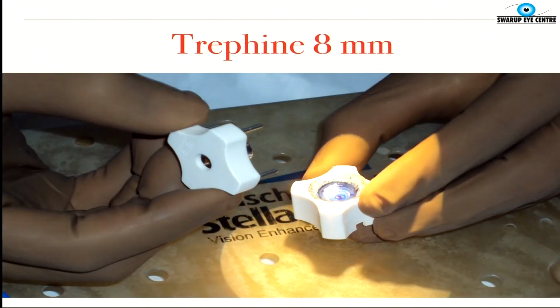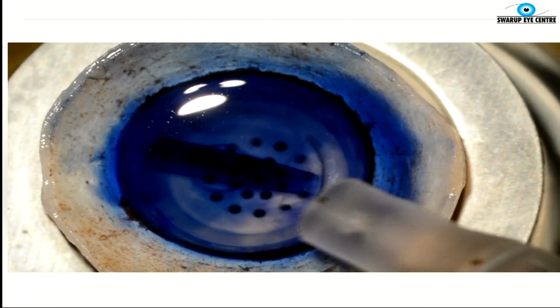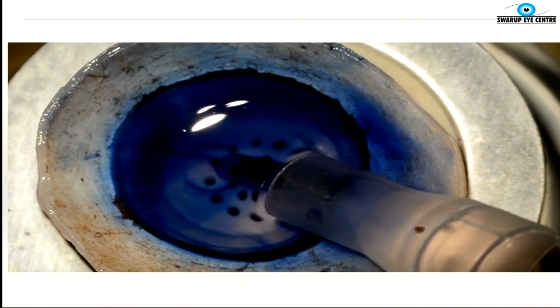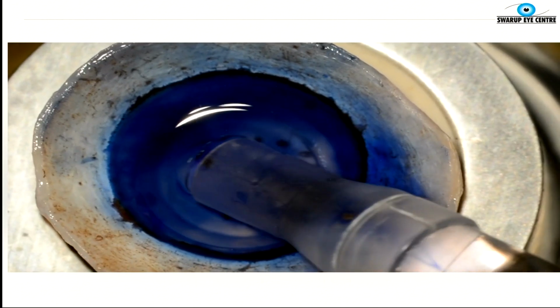After that, you trephine to 8 mm. Ideally, again, this should not be a full thickness trephination, but a partial thickness, just to cut the Descemet's membrane. And then whatever is left can be stripped off. Once that is done, you stain the scroll for about a minute or 2 with trypan blue, and under fluid you can aspirate it using one of the various injectors.